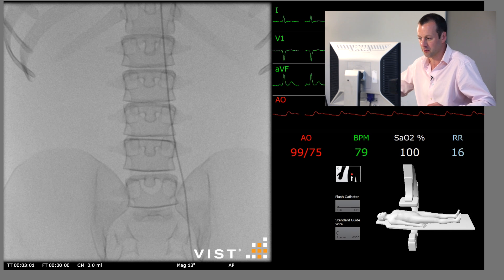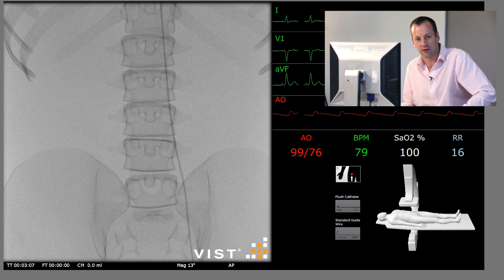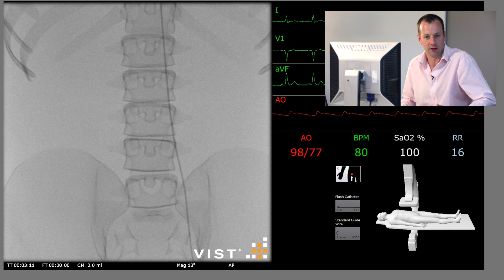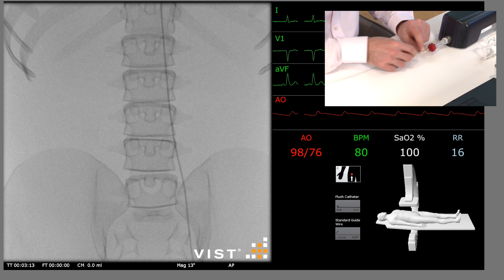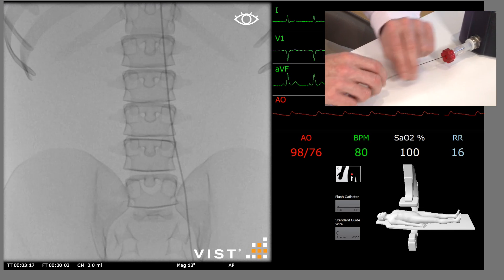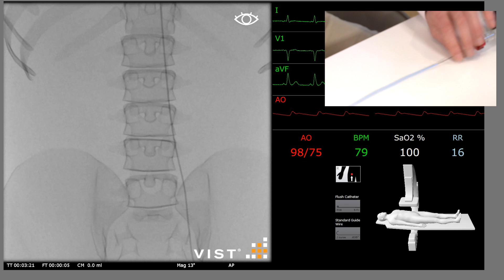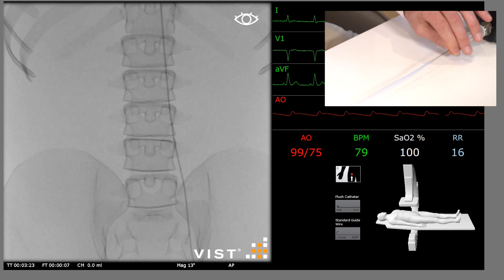This patient has been brought to the operating room. We've already accessed the contralateral left common femoral artery and placed a diagnostic catheter up into the aortic arch. We're now going to access the right side and insert a stiff guide wire, which will allow us to introduce a thoracic aortic stent graft. All size measurements have been taken from the CT scan.